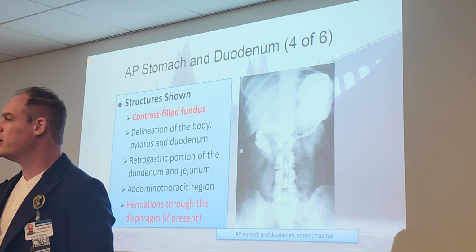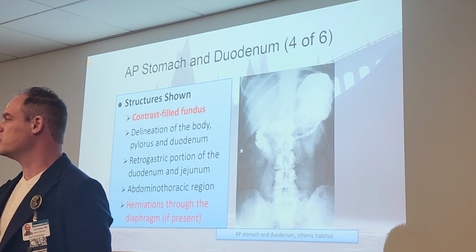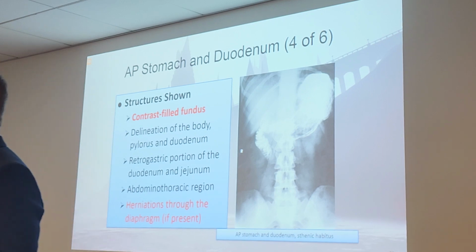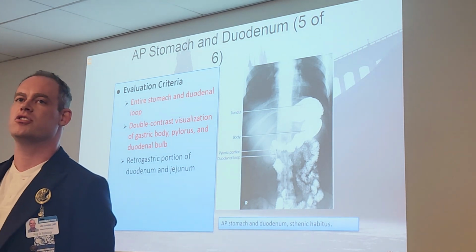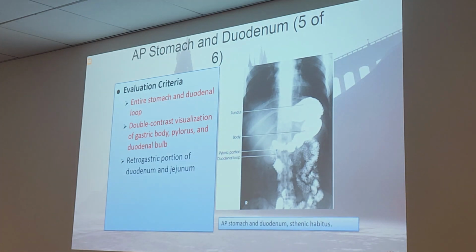And what's the main star of our show here? A contrast-filled fundus. And then, if present, we want to see a herniation through the diaphragm. So on an AP supine, guys, where is the contrast? In the fundus. And where's the air? In the pyloric region, body and pylorus. So what we want to see is the entire stomach and duodenal loop, with double contrast visualization of the gastric body, pylorus, and duodenal bulb. We'll show all of those for AP stomach and duodenum.